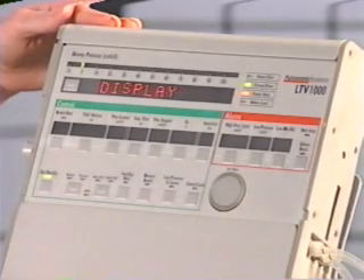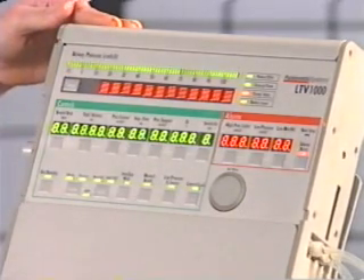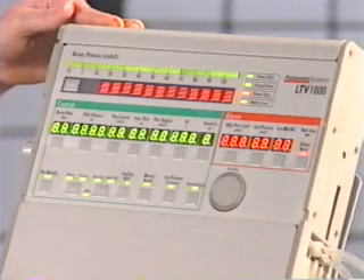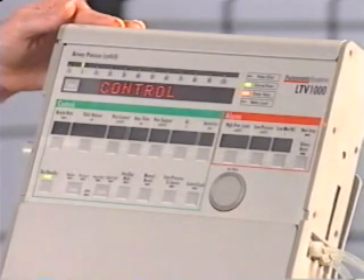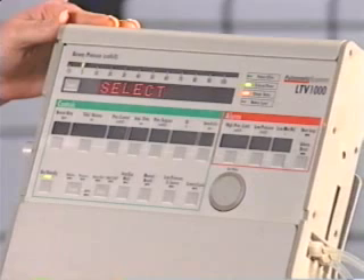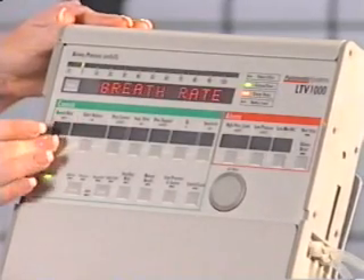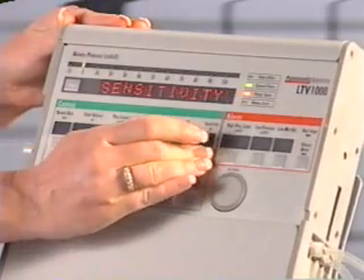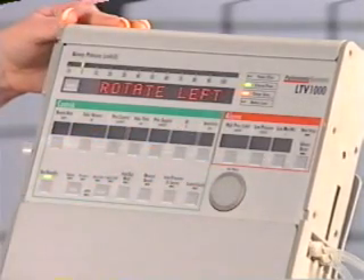Display is now shown in the display window. The display test is used to verify that the ventilator displays are all working properly. To run this test, press the select button while display is shown. All LEDs and displays, with the exception of vent in-op, are now illuminated. To end the display test, press the select button again. Control is now shown in the display window. The control test is used to verify that the ventilator buttons and the set value knob are working properly. To run the control test, press the select button while control is displayed. Select is now displayed in the display window. To test each control, press the button. The name of the button is displayed in the display window. To test the set value knob, turn it clockwise and counterclockwise. To exit the control test, press the select button again.